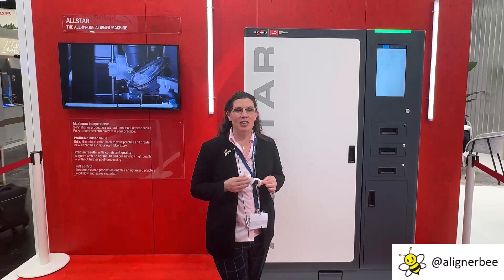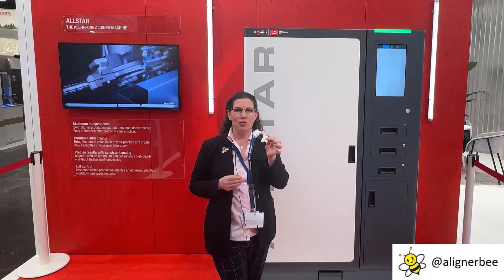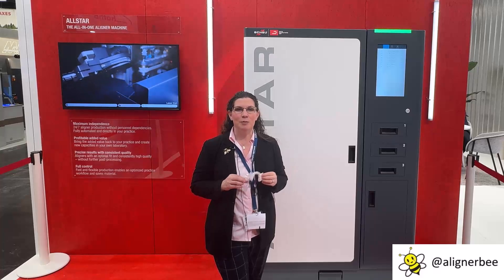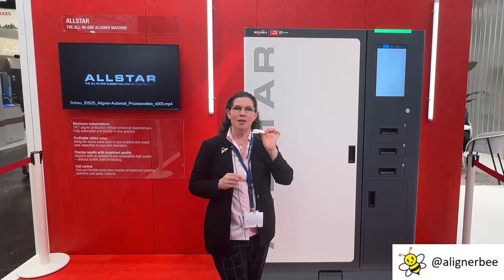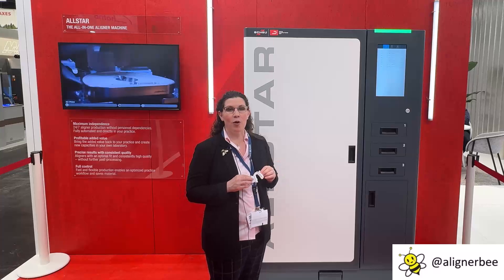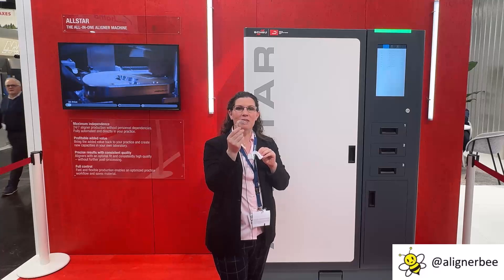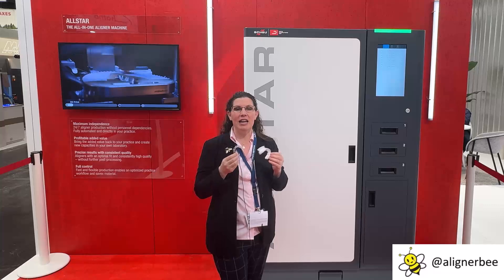They've created a machine that can use fused filament modeling to 3D print our clear aligner models. They're able to utilize any STL file that's been created for 3D printing, print the model, then automate it through the thermoforming process, then utilizing a laser trimmer they are able to trim the aligner and have it ready for delivery in the office.